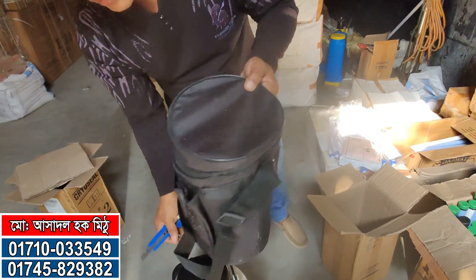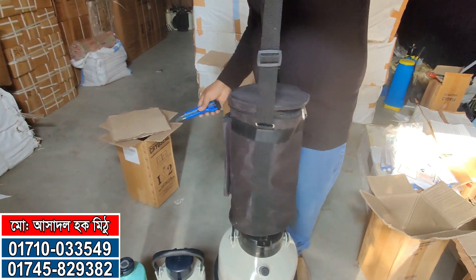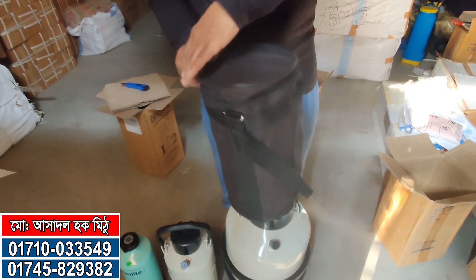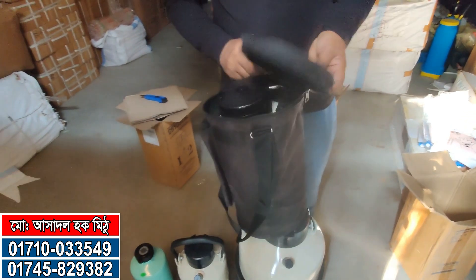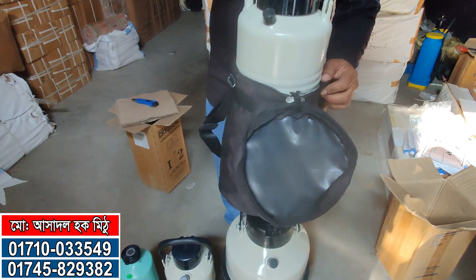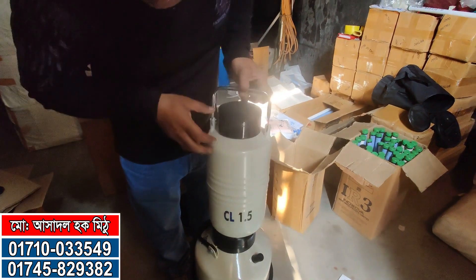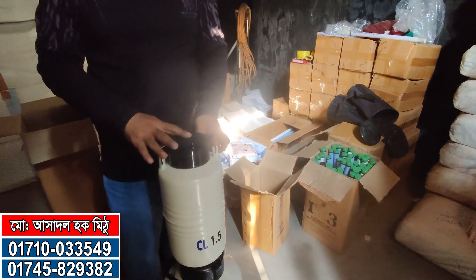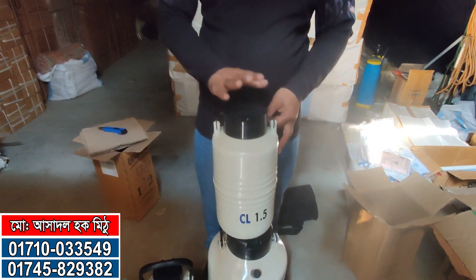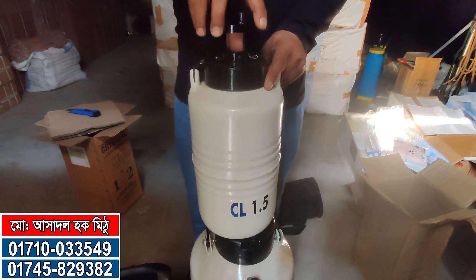The CL company can of 10 litres is very beautiful. This can is 10 litres, 1.5 litres. This model is very beautiful and good. This is dry and very good.